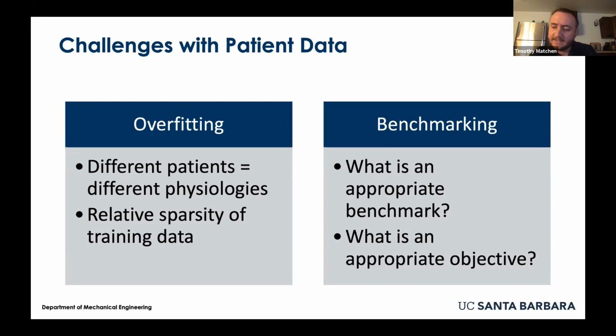So what we decided was, let's take the data that we have and classify different power spectral densities that we get out of our local field potentials as either examples of bursting, so we see a burst in this window where we have an elevation in the beta band, or as no burst in that particular window. So we'll classify them as one of the two things.